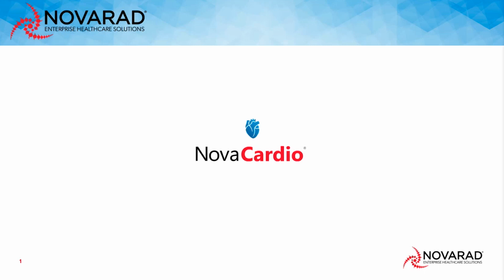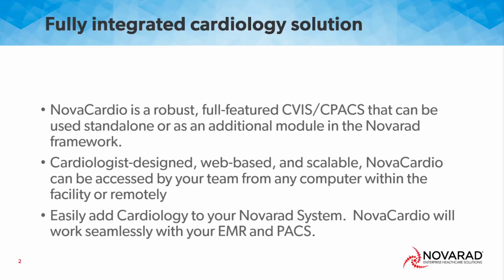So in NovaCardio, this is just an overview. It's a fully integrated cardiology solution. NovaCardio is a robust, full-featured CVIS and CPACS that can be used standalone or as an additional module in the NovaRad framework. Cardiologist designed, web-based and scalable, NovaCardio can be accessed by your team from any computer within the facility or remotely. Easily add cardiology to your NovaRad system. NovaCardio will work seamlessly with your EMR and PACS.